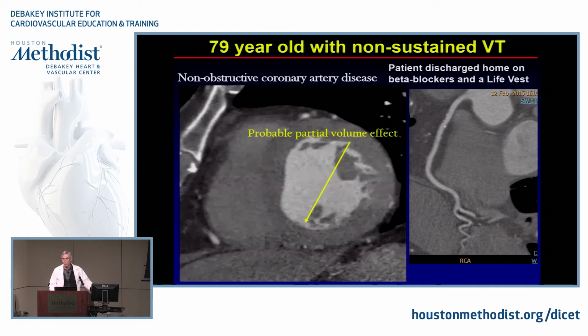Shouldn't you see this a lot, very often, in people with regional wall motion abnormalities? Well, whenever you see someone with regional wall motion abnormalities, and many of those patients who already have diffuse hypokinesis do get varying wall motion abnormalities in different regions. Yes, we always think about that.